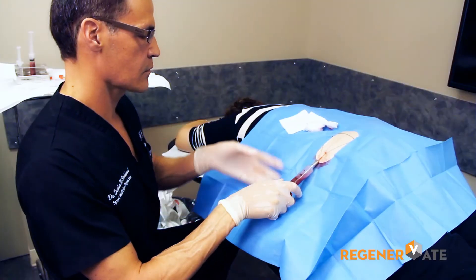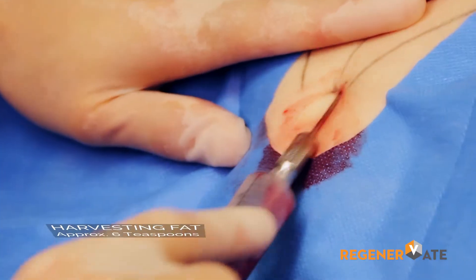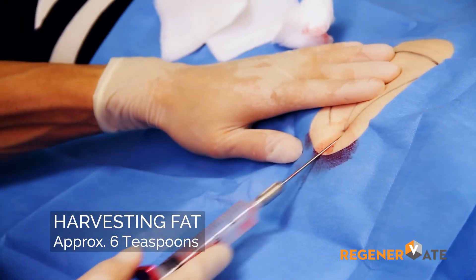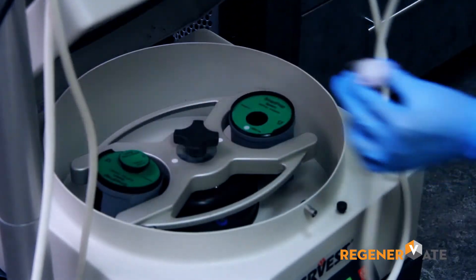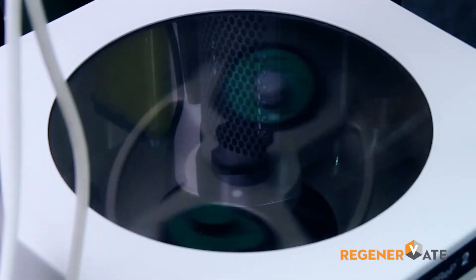We then turn our attention to the patient and start the process of harvesting fat. We can use a variety of areas to harvest fat. My preferred area is the buttock for patient comfort and ease of harvest. Once we harvest enough fat, we separate the fat from unwanted substances by placing the fat in a centrifuge container and spinning this down as well.